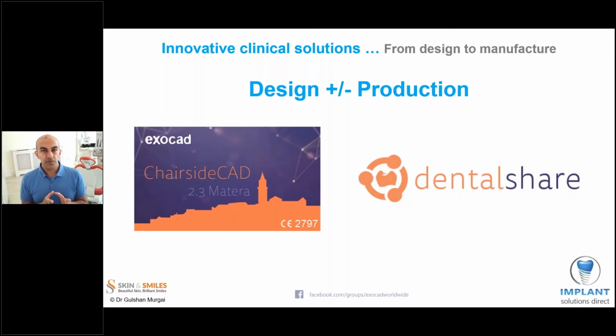So some people will invest first in stages, so they'll buy their intraoral scanner. Later on, they'll say, well, I'm happy with my scanning protocol now, I'd like to start getting involved in design, and they may still be collaborating with a lab or a milling center for fabrication, or they can go the whole hog and purchase 3D printing and milling as well.